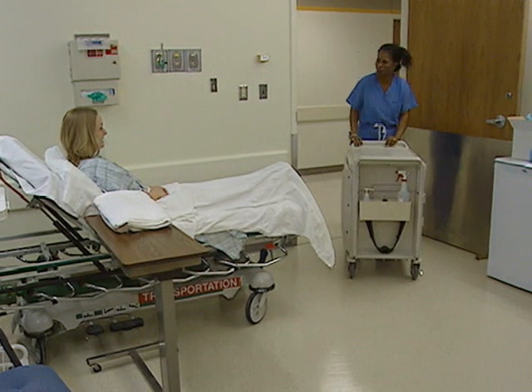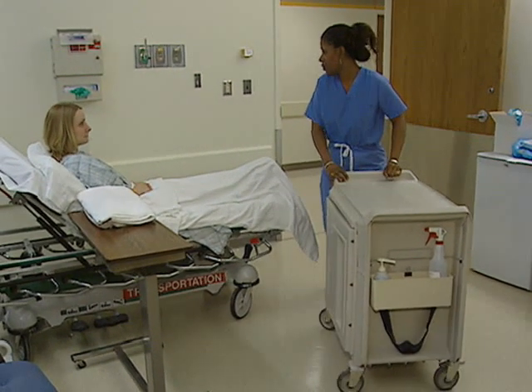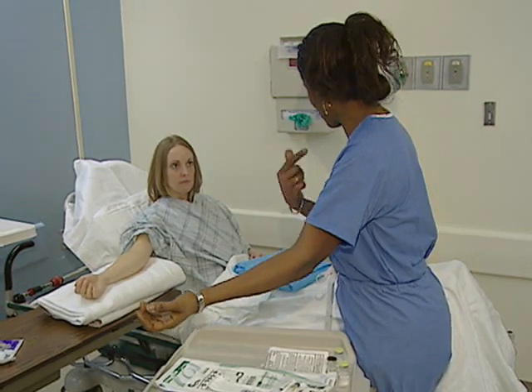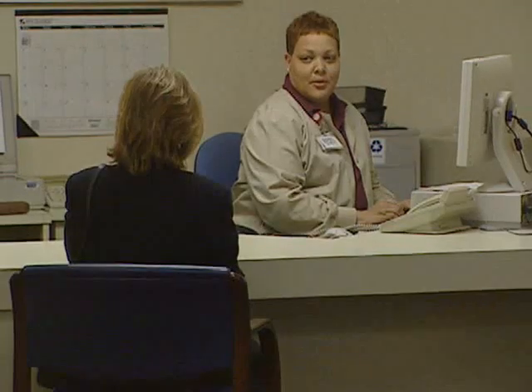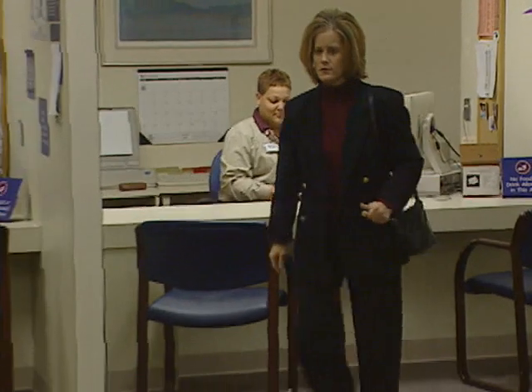Following the procedure, the patient is given pain medication and usually stays in the hospital overnight. It is common for patients to experience some post-procedure pain and nausea. The overall recovery period for UFE is short in comparison to surgical methods to treat fibroids, and most women who undergo the procedure return to their normal daily activities within days.